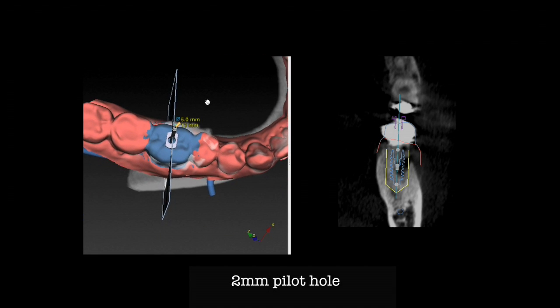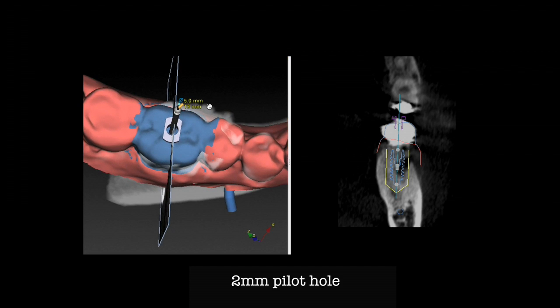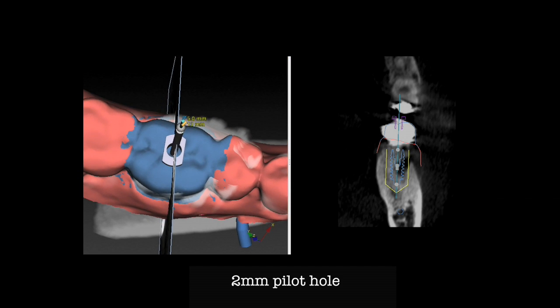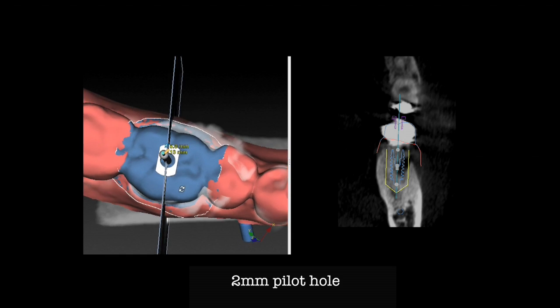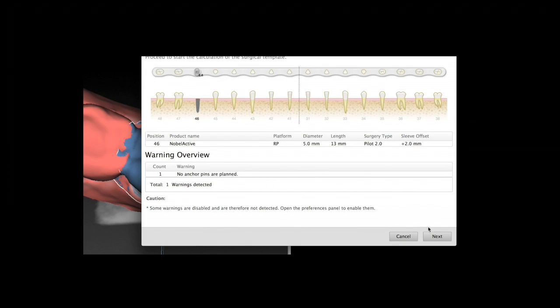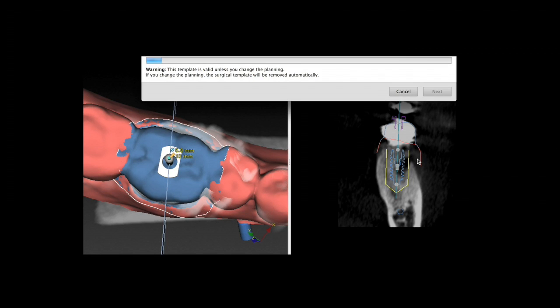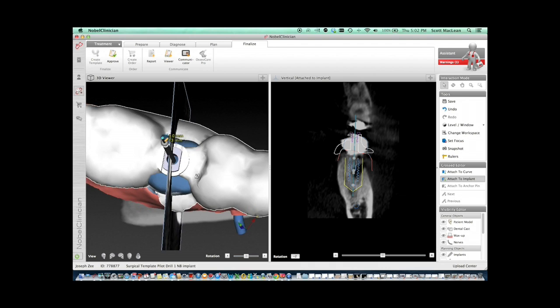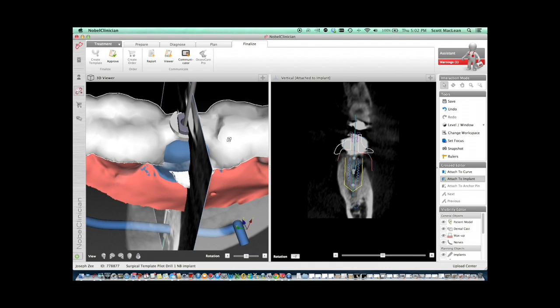The purpose of the guide is to get the correct angulation and depth of the implant so you can do a really great final prosthesis. We are going to be using a 2mm pilot hole guide here, and by envisioning where the nerve is, where the bone is, the angle, and where the upper tooth is, we can get this implant exactly where we want — even on an immediate basis. Right after extraction, we will be able to place this guide and get this implant into the exact position for long-term success.